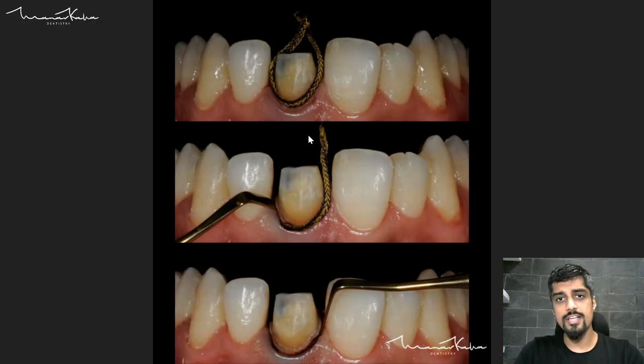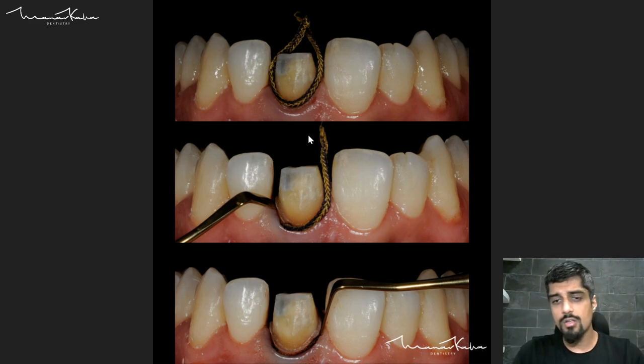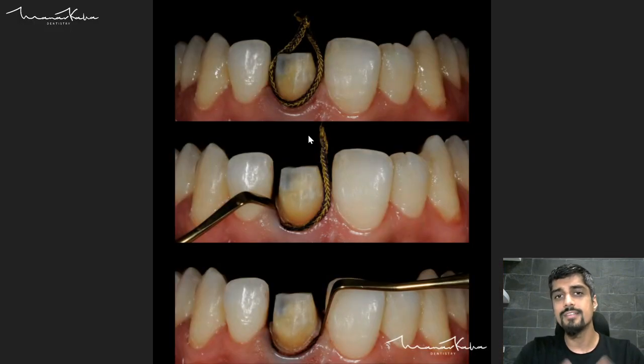Now for the impression, we are using a thicker cord retraction — not the thin cord used for tooth preparation. You can either go for a single cord retraction or a double cord retraction. Here I have chosen single cord retraction because we are getting enough retraction with this kind of cord.